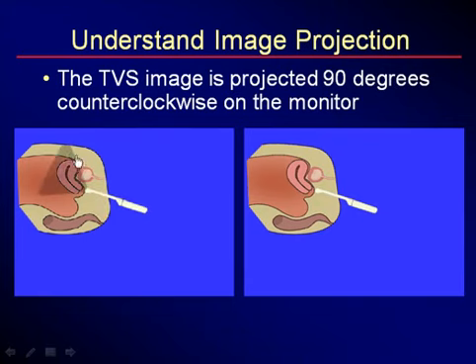So this is anterior here. This is the anterior part of the uterus. And when it's rotated, this is anterior. So this is anterior, posterior, this is cranial, and this is caudal. Let's do that again. See, caudal is this way, caudal, right here. This is cranial, anterior, posterior.